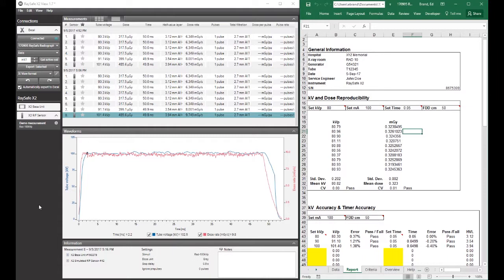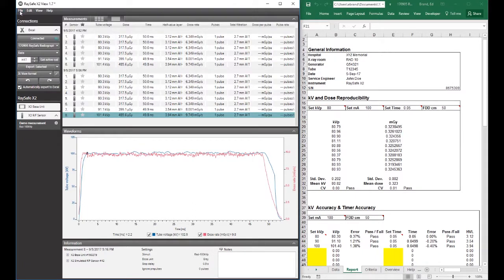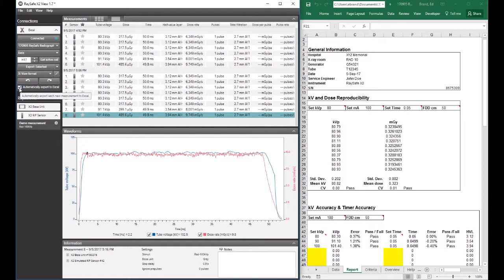I've actually populated our kV and our exposure time for the kV accuracy and timer accuracy tests. So that's all there is today. So it's easy. You just hook up your base unit to your laptop. Start X2 view. Either retrieve data or import data from the base unit, as I showed you.